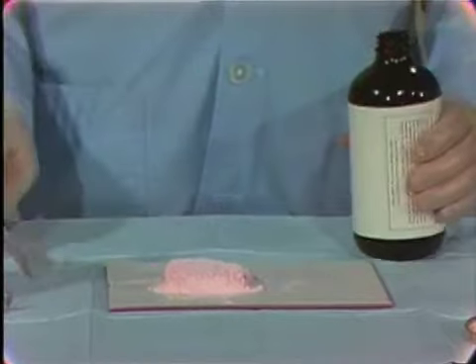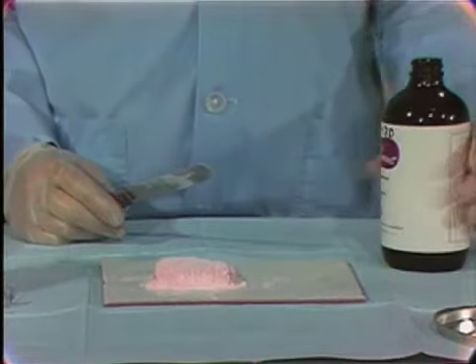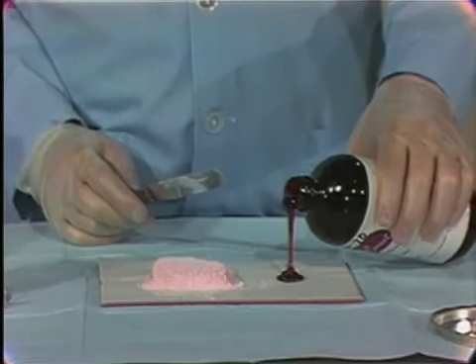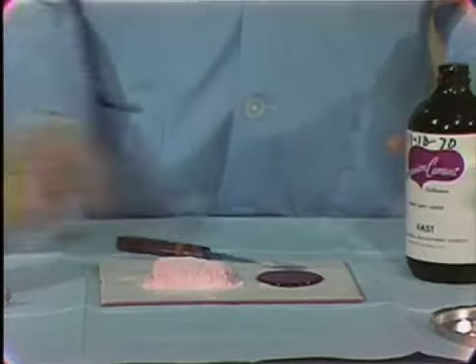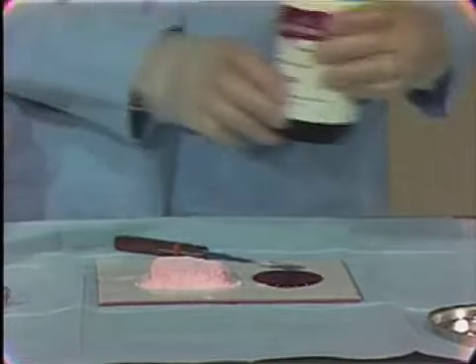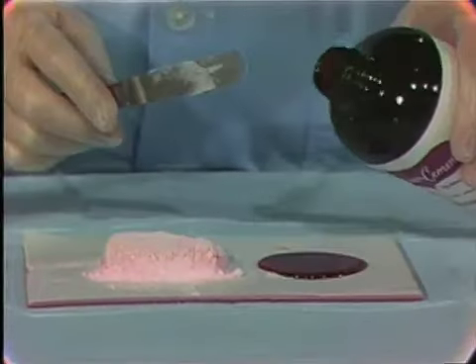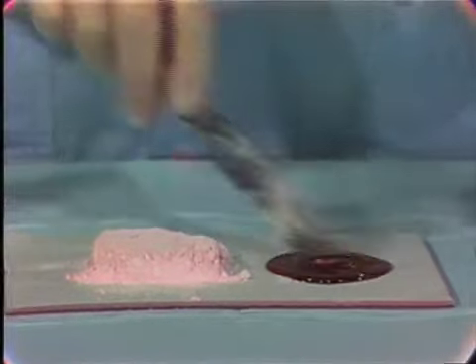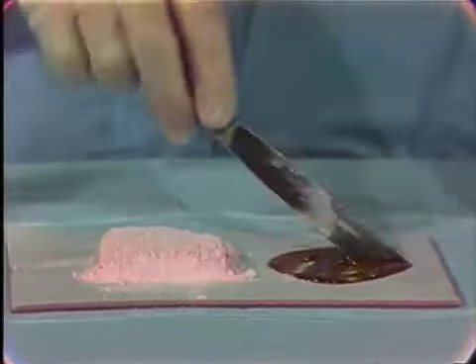Now, for routine conditions of temperature and humidity, we would use about 75% fast liquid and 25% of the slow liquid. So we'd pour out an area of liquid. That's the amount of fast liquid we need, and then we can pour out the 25% slow, and mix the two together. Now the patient should be ready.